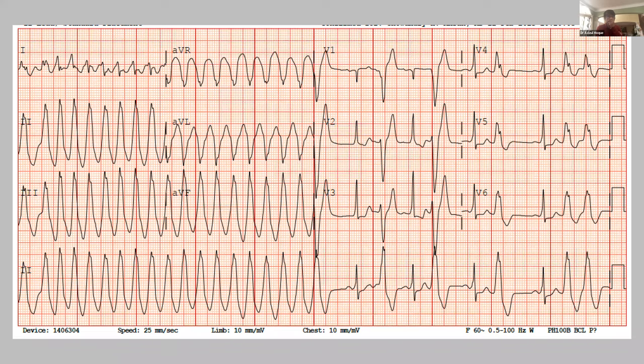If we look at lead V1 first, the QRS is relatively narrow, and then there is early transition. If it is true lead position, that's suspicious. But the wide QRS in V1 has a possible negative delta wave, but the next one doesn't. And then in V2, the initial R wave is narrow. So that's why your EP physician said, maybe not.